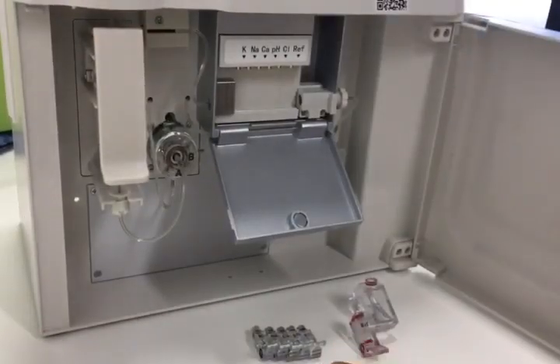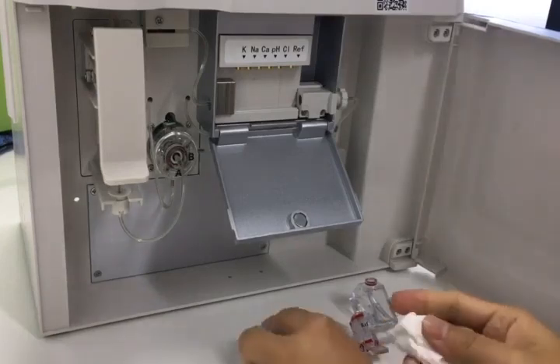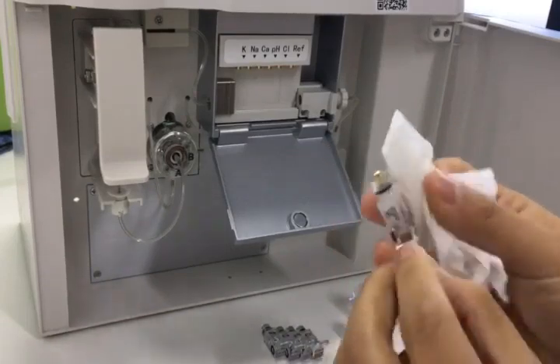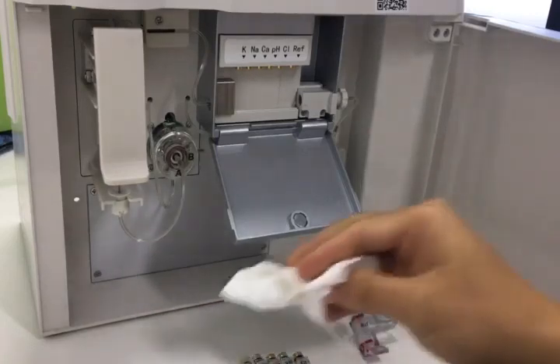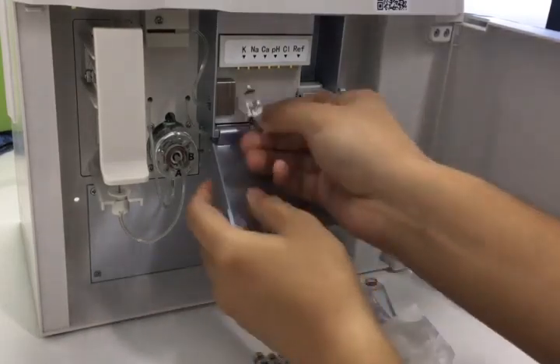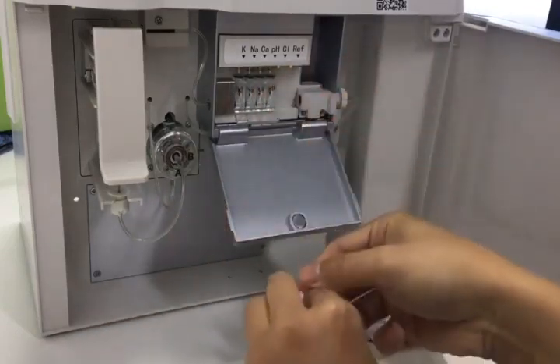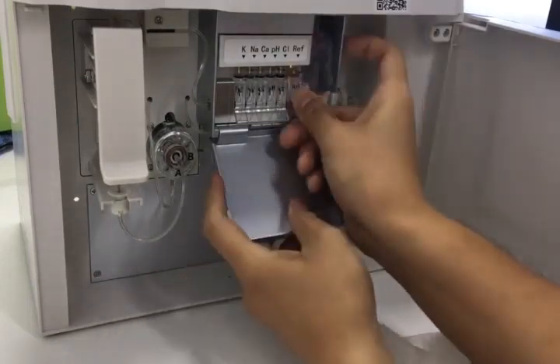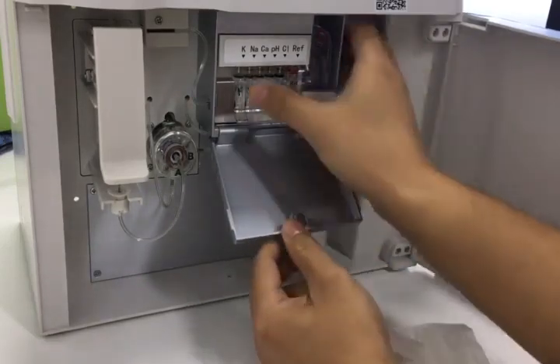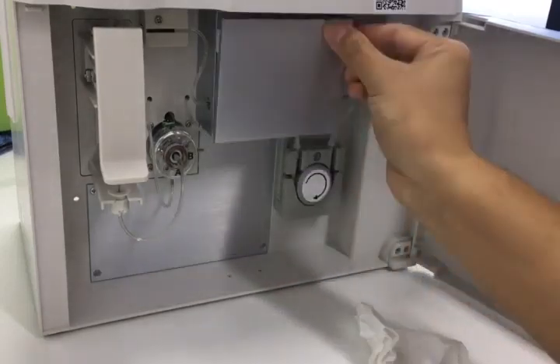Before installation, use tissue to clean the metal contact on the electrode box. Then use tissue to clean the metal contact for each electrode and the gas ring, to keep the electrodes clean. We need to remove the bubbles in each electrode. Then we can install them. Tighten the knob and press to keep them in a single line, then tighten them and close the box.